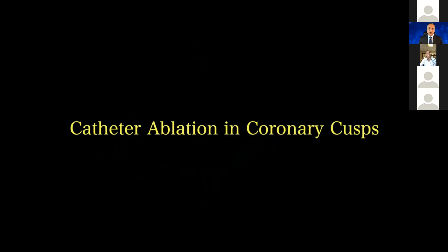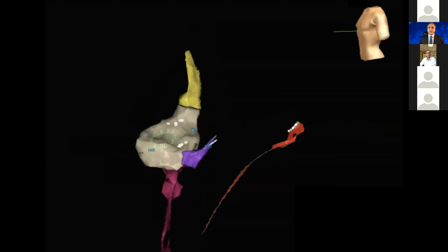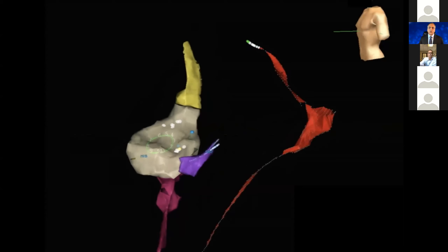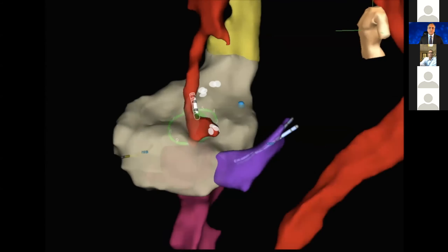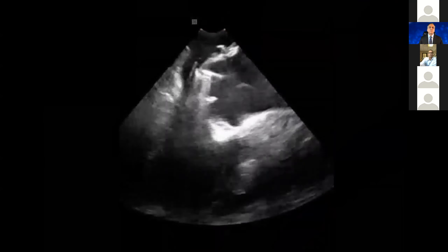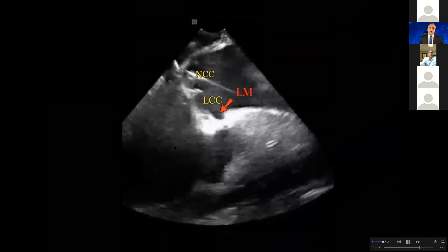How about catheter ablation of the coronary cusp? If you are doing the coronary cusp, you're going to advance your ablation catheter straight towards the coronary cusp. You are not going to perform a candy cane in the descending aorta as I'll show you next — you're just going to go straight towards the coronary cusp. Here you can see the ablation catheter is right there. My ICE is showing the non-coronary cusp, and you can see the left coronary cusp and the left main. If you clock the ICE, you always see the left coronary cusp in the home view, but once you've advanced a little, you see the ICE catheter is close to the aorta. On the top it is always the non-coronary cusp.